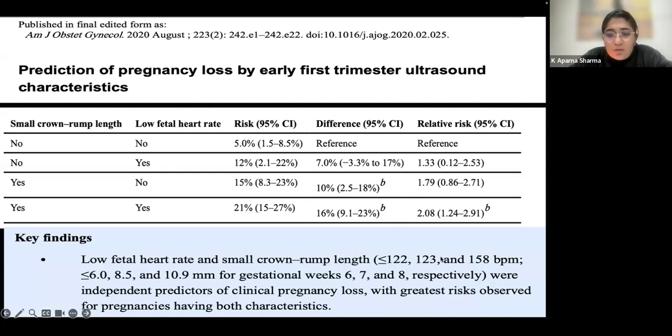Can I say something here? Yes, please. When we first see the fetal heart by TVS, generally it is around 80 to 90. I also want to add my experience of scanning by TVS, that even before measuring CRLs, we can see the fetal heart.